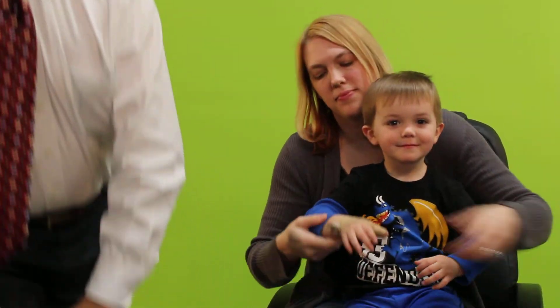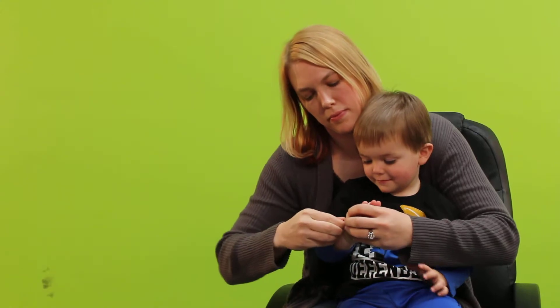Lincoln, thank you. You did a great job. Can you show me the glove? Show me the badge of glove. Can you go like this? There you go. Bend your thumb in a little bit. Good job. Now I'm going to get close-ups of this.